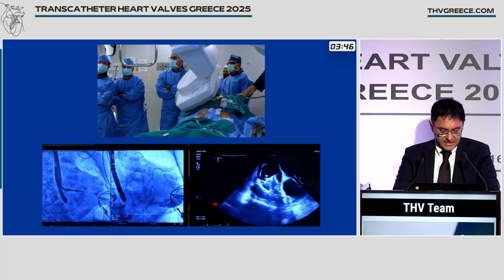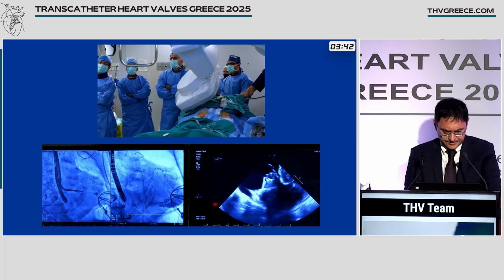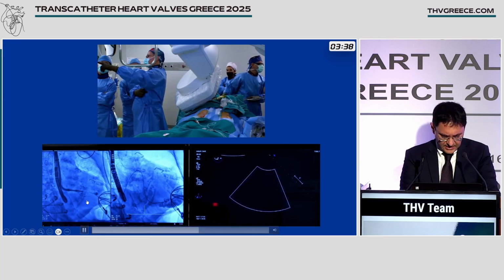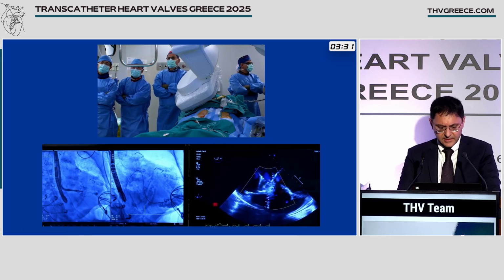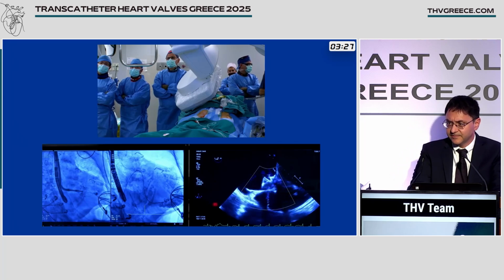Now we can also see the tube in the middle between the graspers that we are going later on to place orthogonal to the membrane of the septum. Kyriakos, yes.